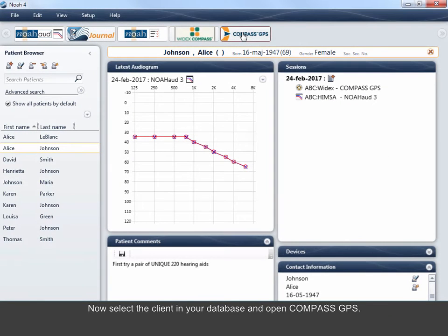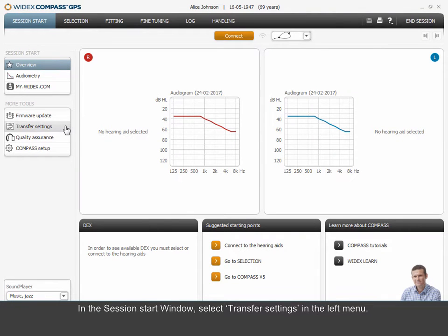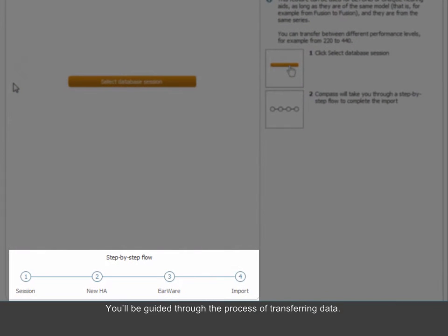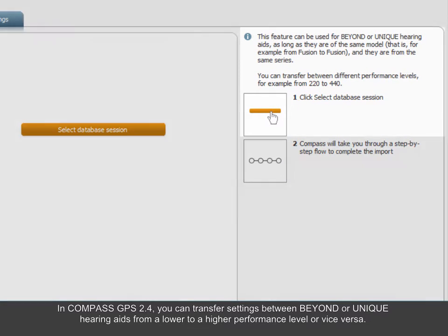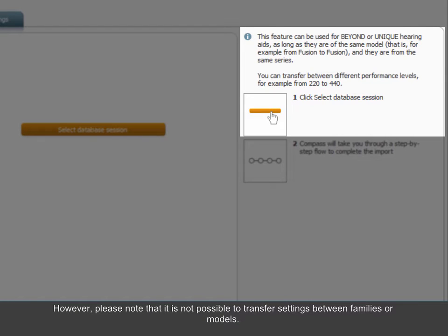Now select the client in your database and open Compass GPS. In the Session Start window, select Transfer Settings in the left menu. You'll be guided through the process of transferring data. Remember to pay attention to the information shown on the screen. In Compass GPS 2.4, you can transfer settings between Beyond or Unique hearing aids from a lower to a higher performance level or vice versa. However, please note that it is not possible to transfer settings between families or models.